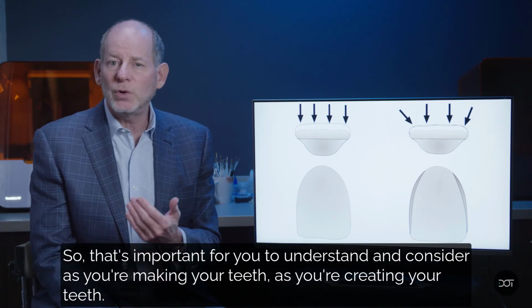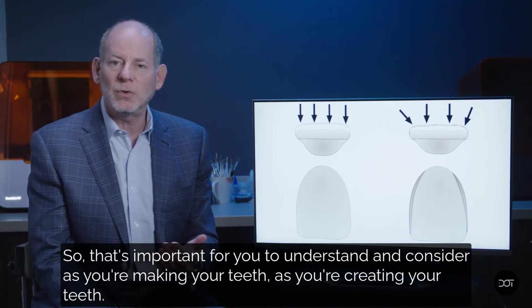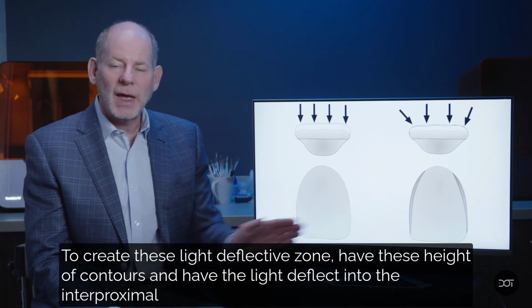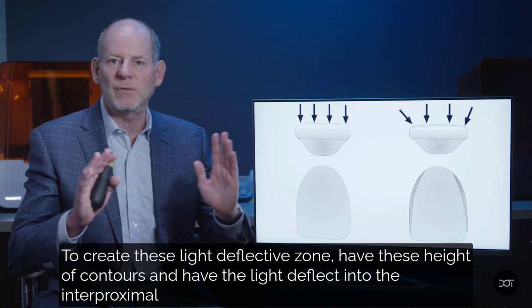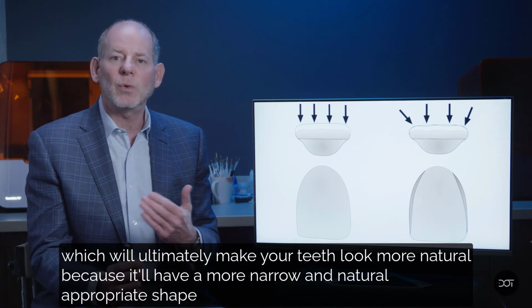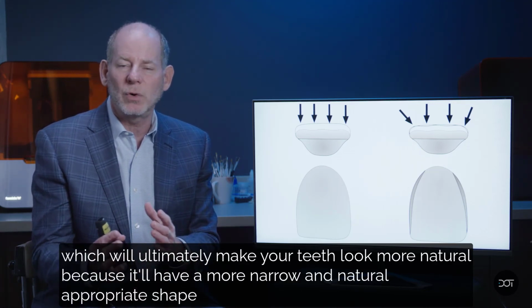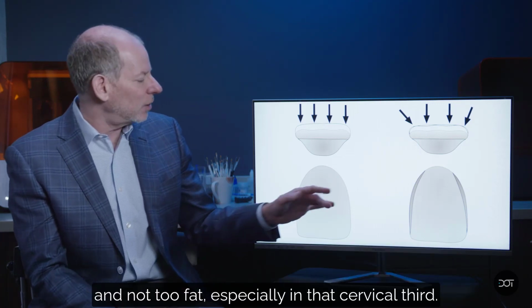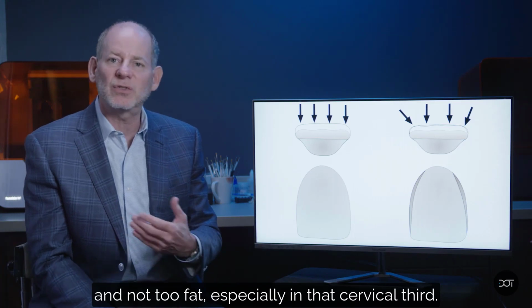So that's important for you to understand and consider as you're creating your teeth: to create these light deflection zones. Have these height of contours and have the light deflect into the interproximal, which will ultimately make your teeth look more natural because they'll have a more narrow and appropriate shape and not look too fat, especially in that cervical third.